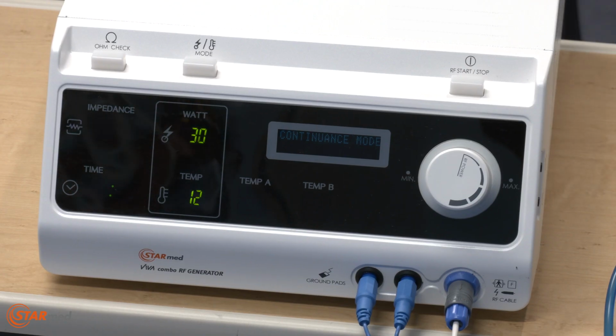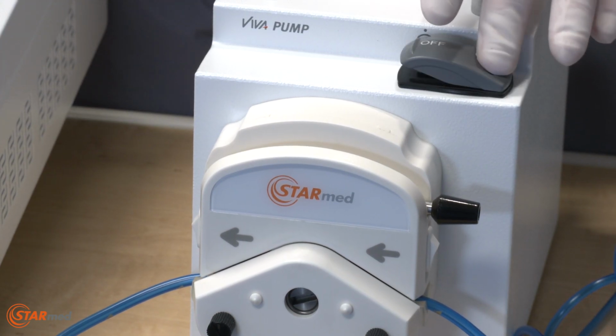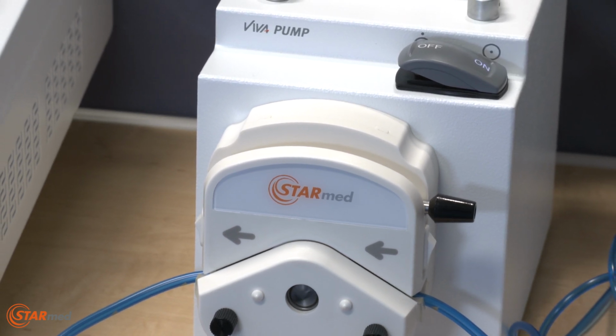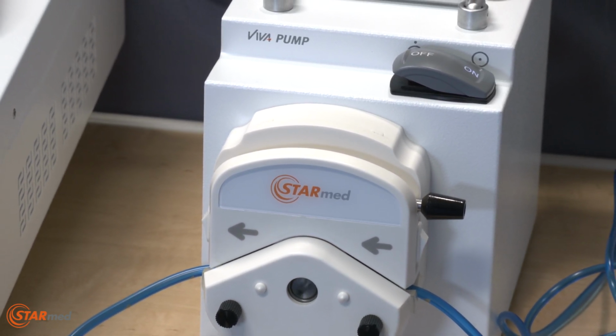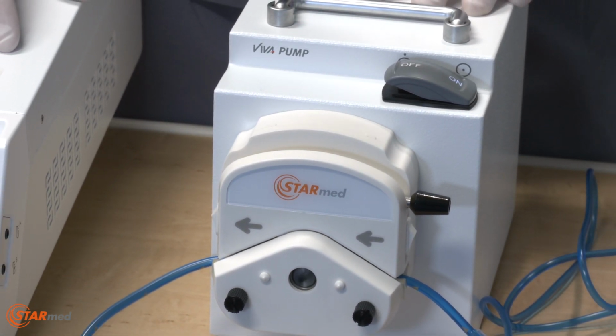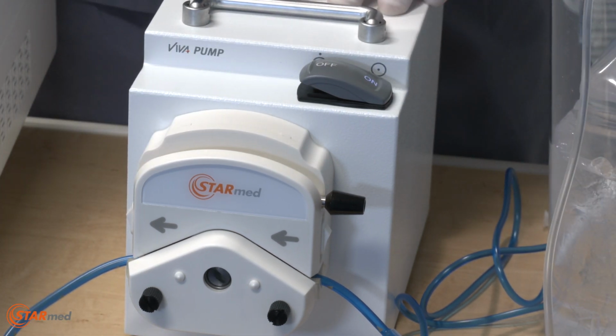This is a good time to check the temperature to verify there aren't any connectivity issues, and check that the display reads the approximate room temperature. As the pump is turned on, the temperature decreases. Let the pump prime for 15 to 20 seconds to allow the chilled saline to circulate through the electrode. We want to maintain a temperature of about 10 degrees Celsius throughout the procedure.